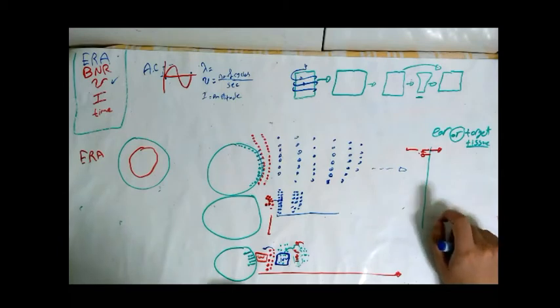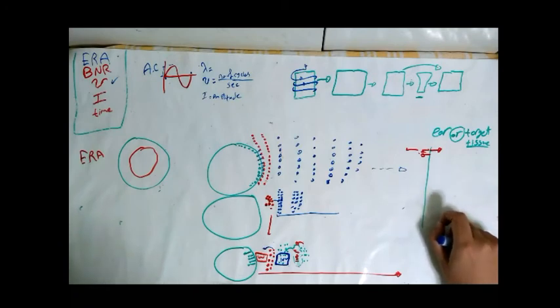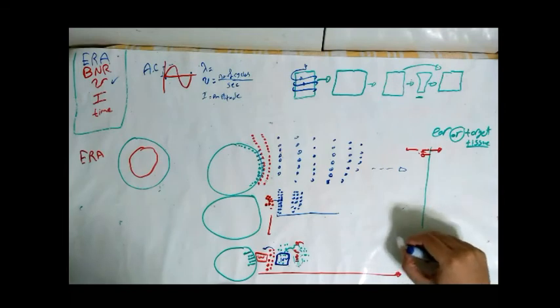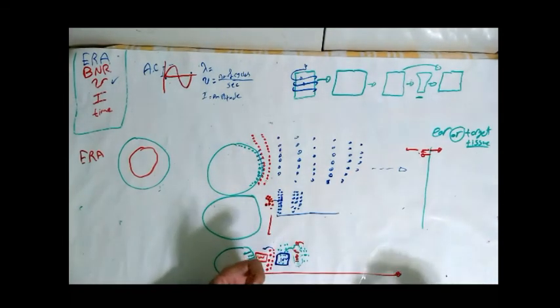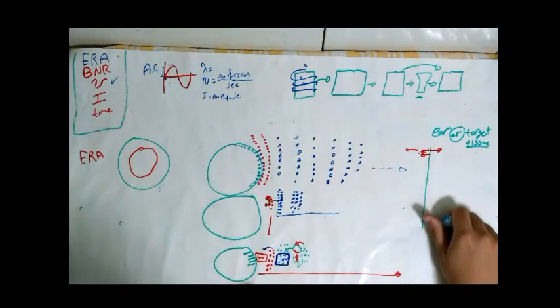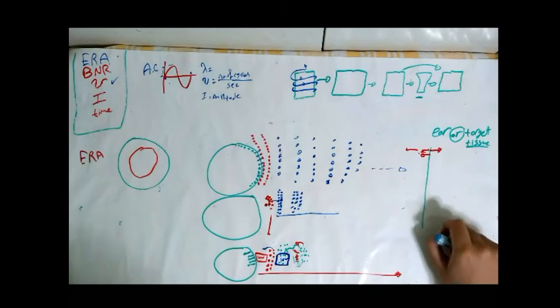If the cavitation bubbles are small and don't explode, we call it stable cavitation. If the bubbles explode, like I did to my PIP joint, it will cause micro explosions around the soft tissue, which may lead to damage to the soft tissue.